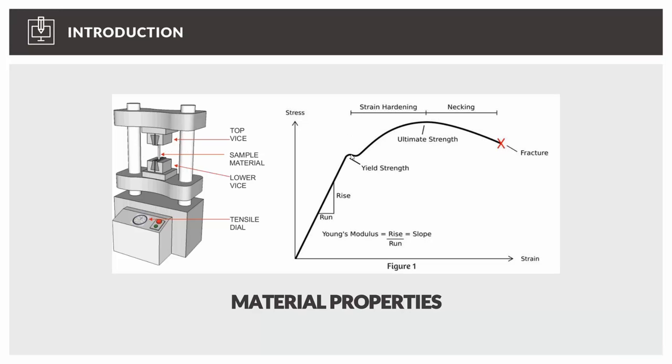And what is happening basically here is that I will get this kind of curve. So at the beginning, the stress will still increase until I have a maximum, and then it will drop. And suddenly, soon after the drop, usually your material probe fails. And why am I telling you that?